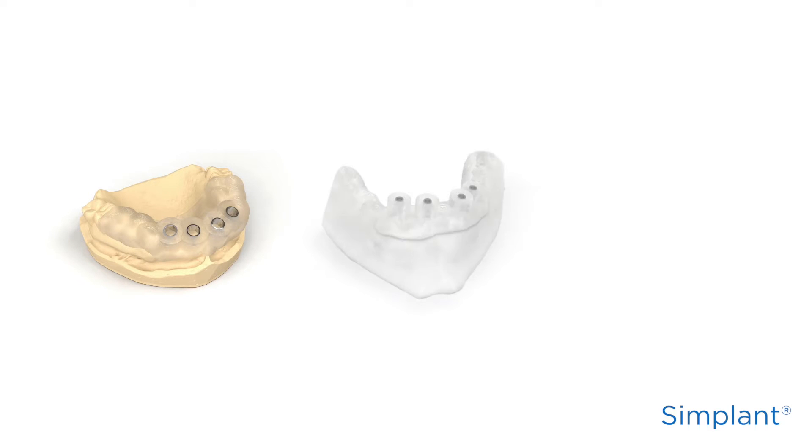Successful implant treatment is the result of a precise and well-planned surgical procedure. Take your time to prepare the Simplant Guide and the surgical instruments that you will use.